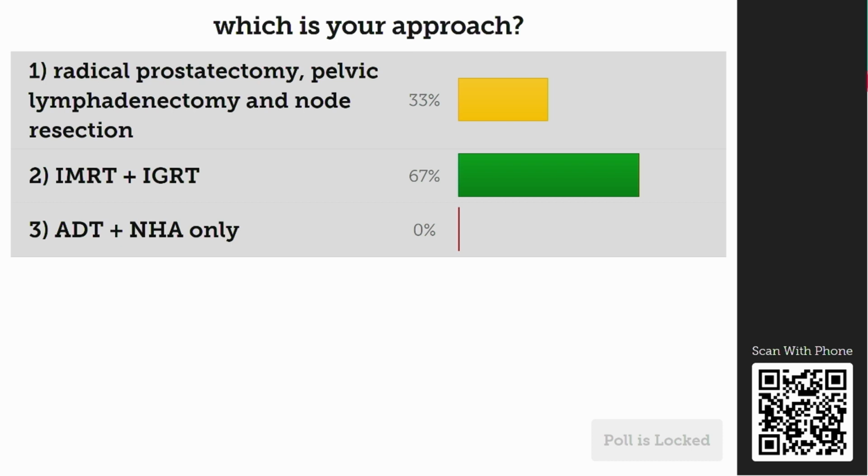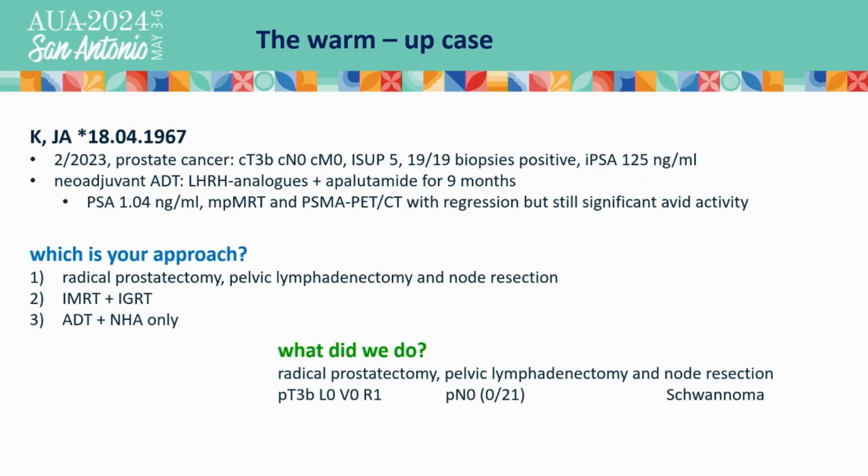I mean, prostate and seminal vesicle and the whole pelvis is clear based on the prospective randomized trials. You should always include the pelvic lymph nodes, but we still have this small nodule which could be treated by continuing the ADT for maybe a year or 2 years, but which probably cannot be treated by radiation therapy because you have a very high risk of a fistula. So what we did is we went for radical prostatectomy.